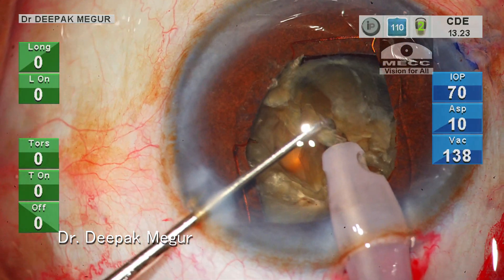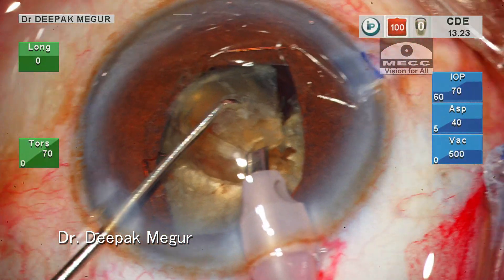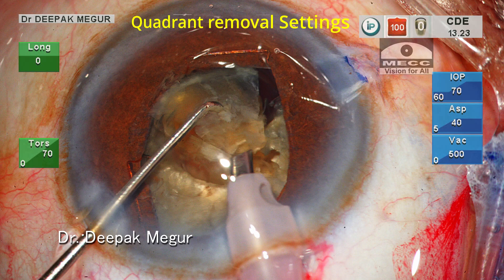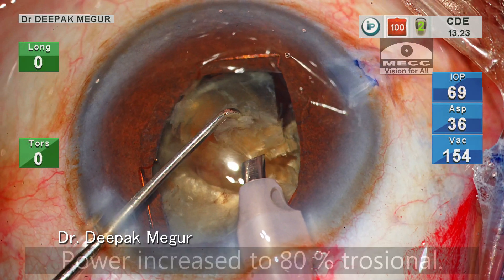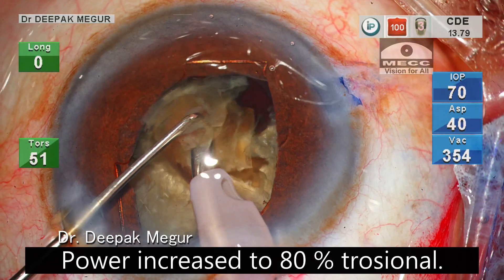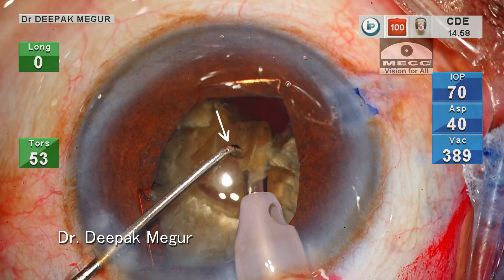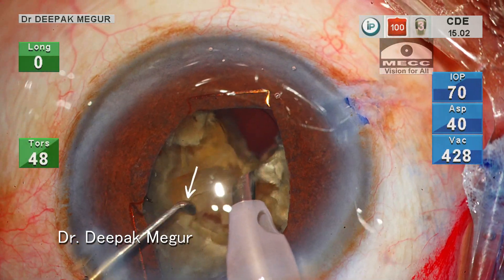Now I want to remove a couple of these fragments to create more space in the bag. My settings are changed — I'm now using only continuous torsional with high flow and vacuum. Please note that the fragments are being emulsified at the pupillary plane and the chopper is placed above the fragment during emulsifying.